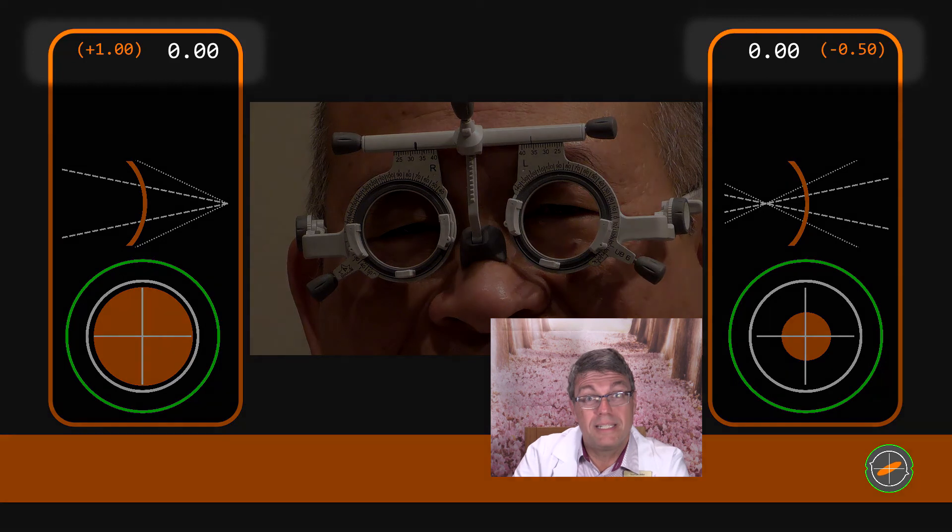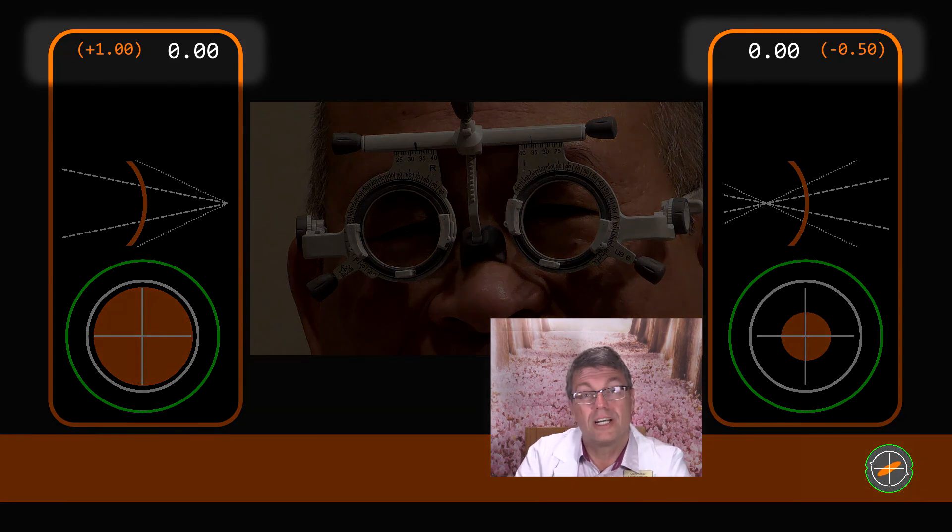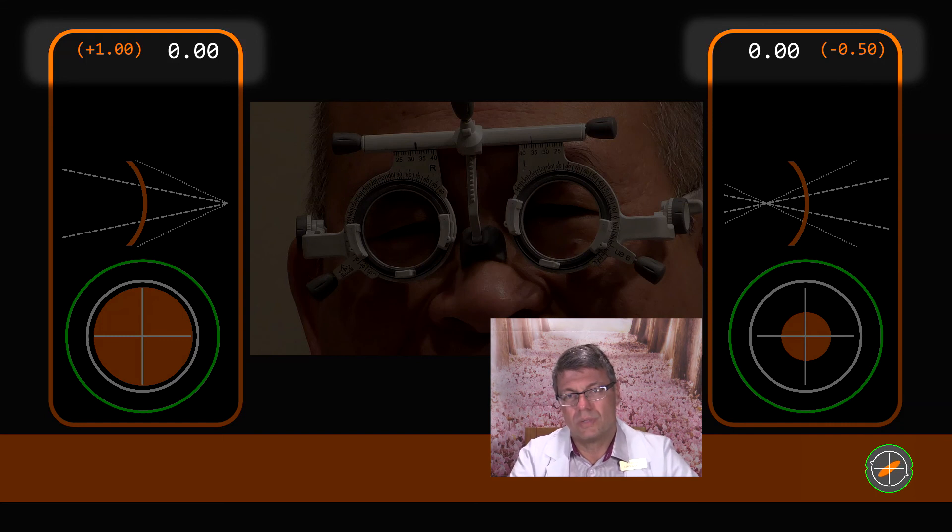As you can see I deliberately over corrected his right eye by plus one and under corrected his left eye by minus 050. As you know it's common for your autorefractor to under plus hypermetropes and over minus myopes. So the right eye is a reconstruction of this situation. The left eye will demonstrate adding minus lenses which as you'll see must be treated entirely differently from adding plus lenses.